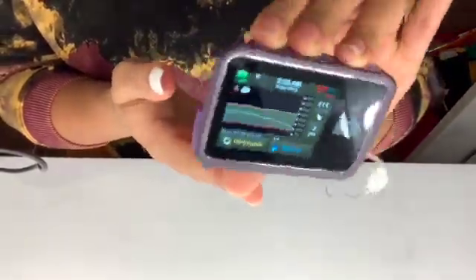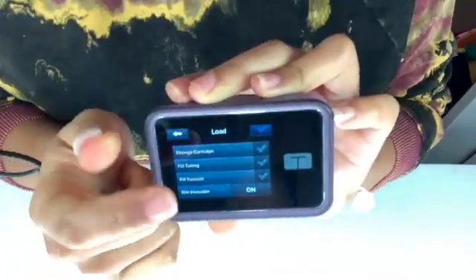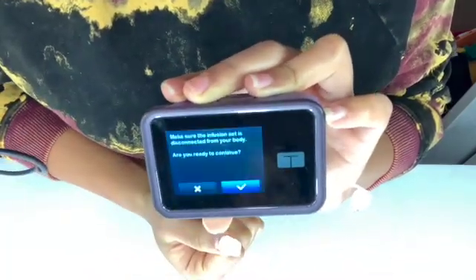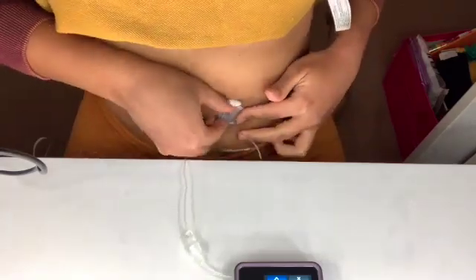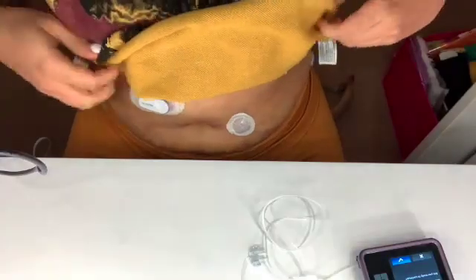And this is my insulin pump. This is how it looks. So first off, you're going to go to options after you unlock it. Then you're going to go to load and then change cartridge. It's going to ask you, are you sure you want to do this? It's going to stop insulin. You're going to say yes, press that little arrow. And then immediately unplug yourself, because you don't want it to give you insulin.